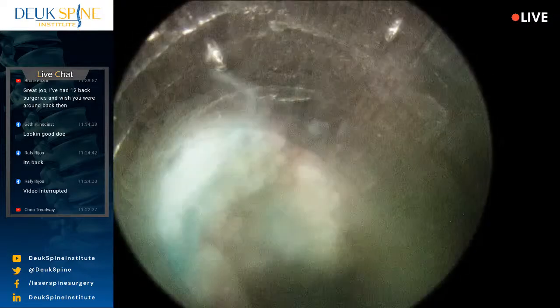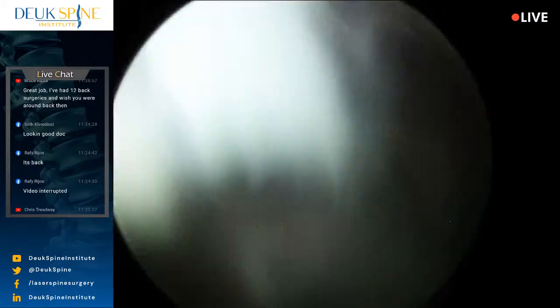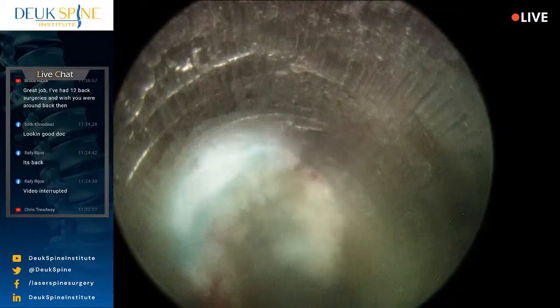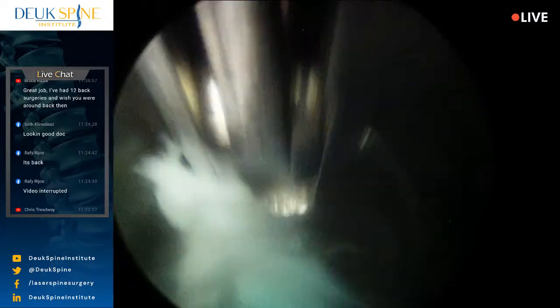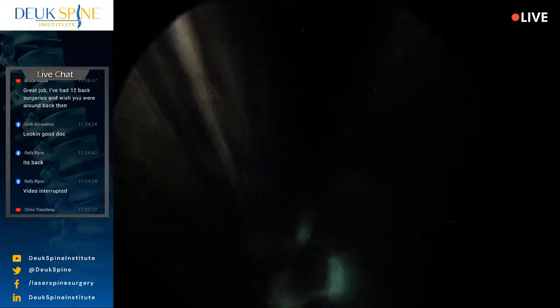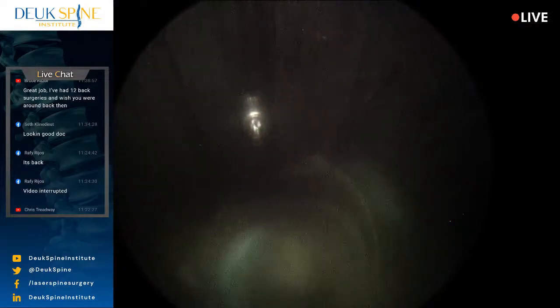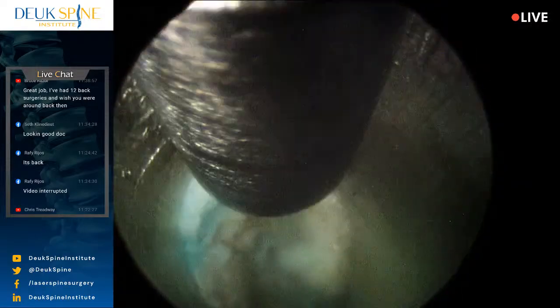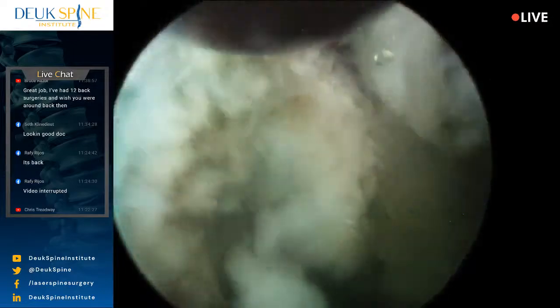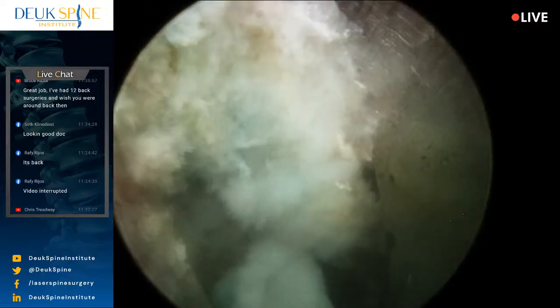So, this instrument I'm using is called a pituitary rongeur. Look at all the fragments of herniation. So, that's an indication that this didn't happen too long ago. Because with older herniations, there's scarring. And they don't float around like that. They stay clumped together. So, the timeline of her injury is consistent with what I'm seeing here endoscopically.